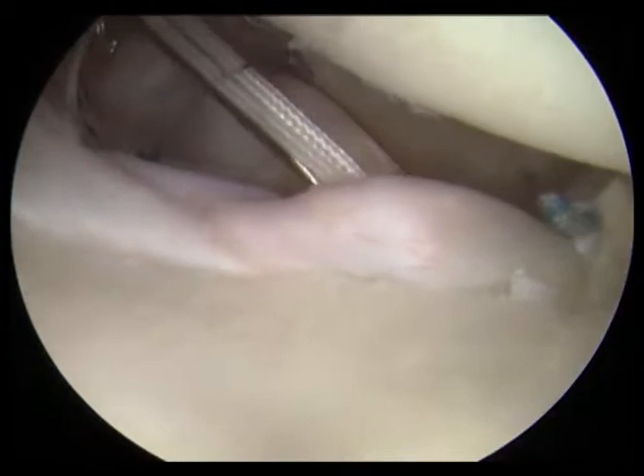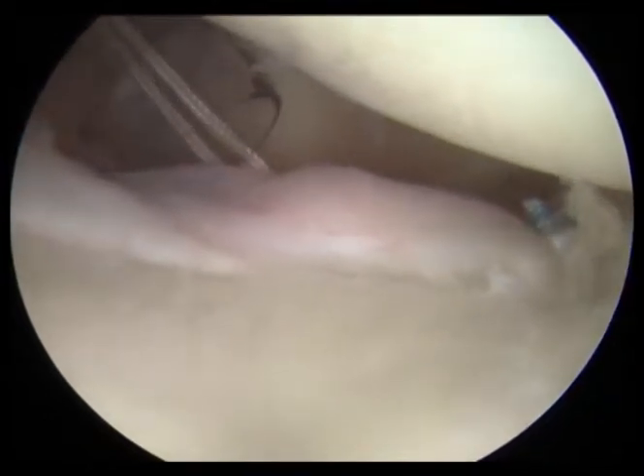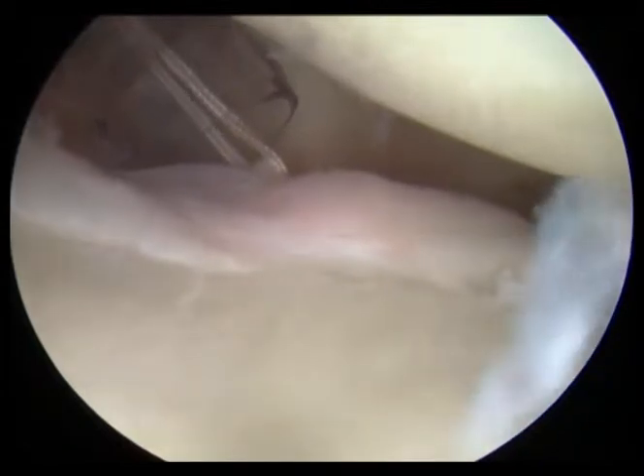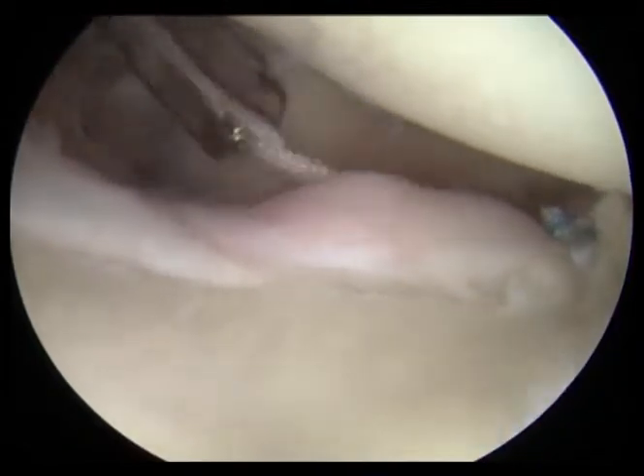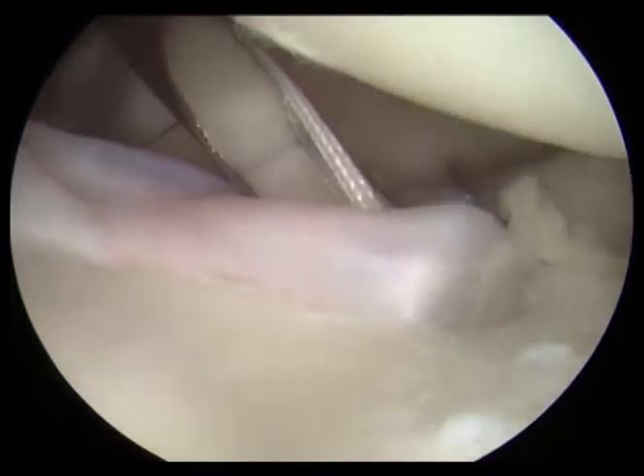We're starting at the five o'clock position on the clock face — down to the right — and now we're at about the three o'clock position tying our sutures. You can already see the labrum is really being pushed right back up against the bone where it needs to be.